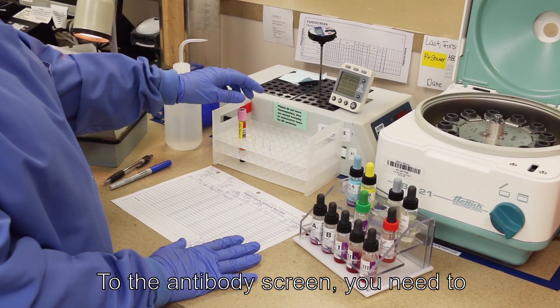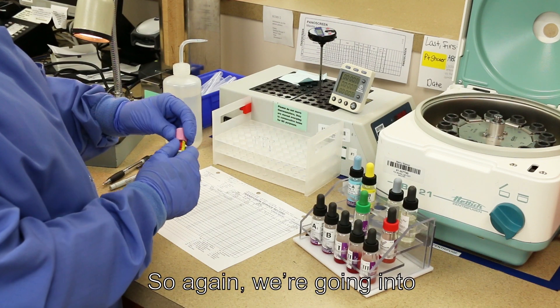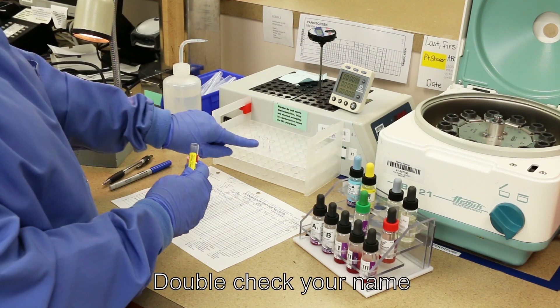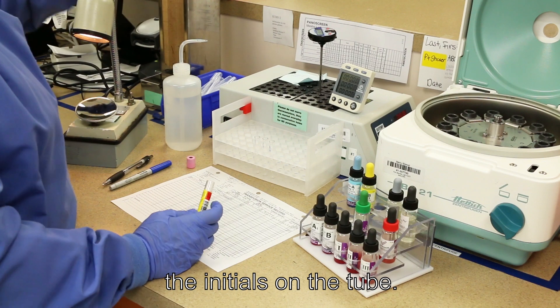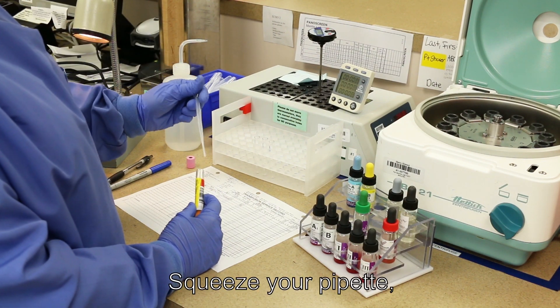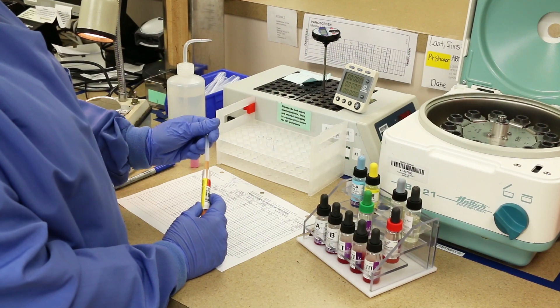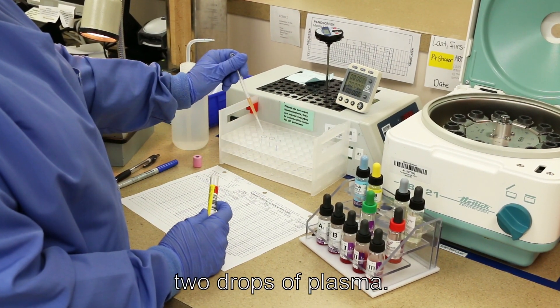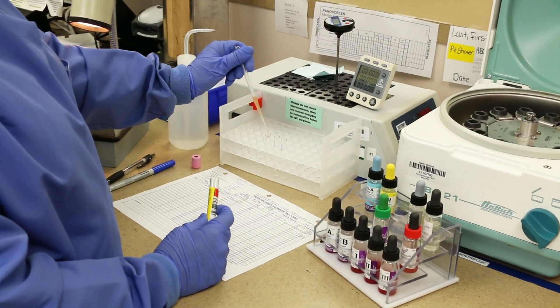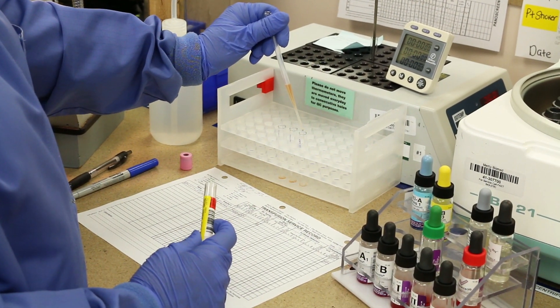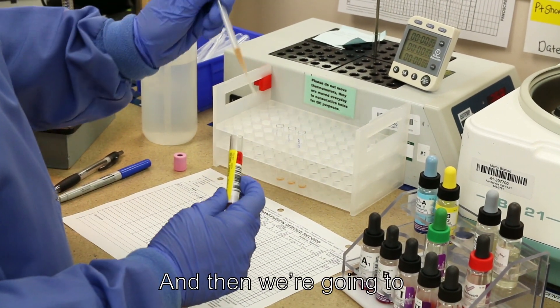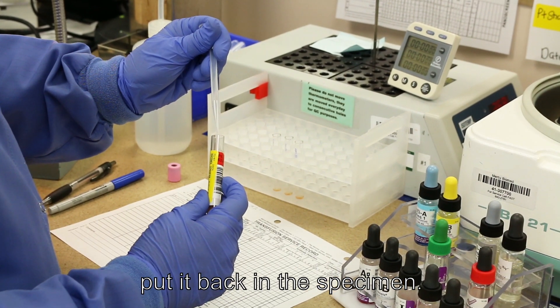To the antibody screen, you need to add the patient plasma. So again, we're going to go into our patient specimen, double check your name, make sure it matches the initials on the tube, squeeze your pipette, go down and get plasma. And again, we're going to add two drops of plasma. We're adding our lightest reagent first. And then we're going to save this plasma, put it back on the specimen.